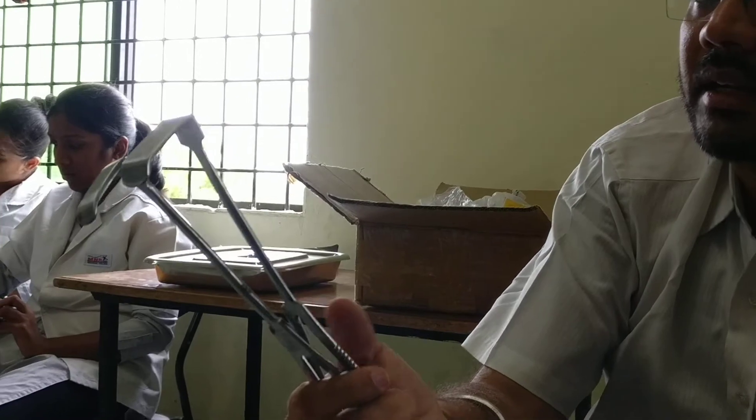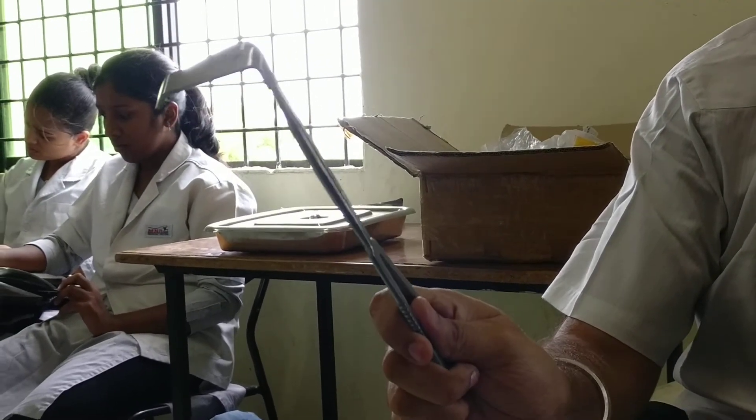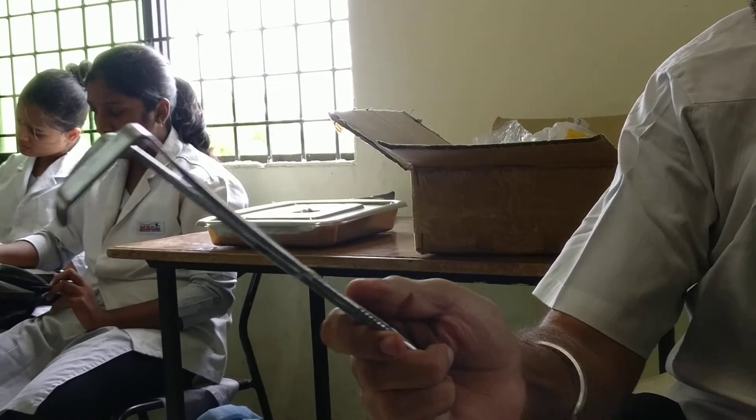So this is called Langenbach's 90 degrees retractor — Langenbach's 90 degrees retractor.